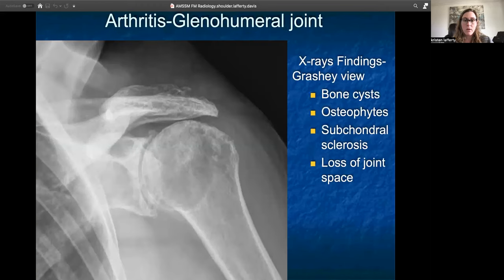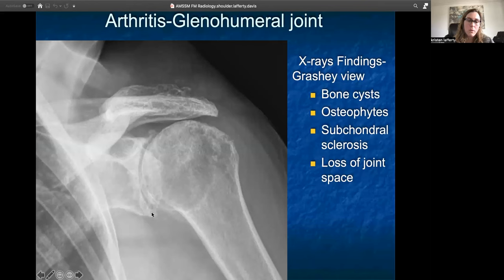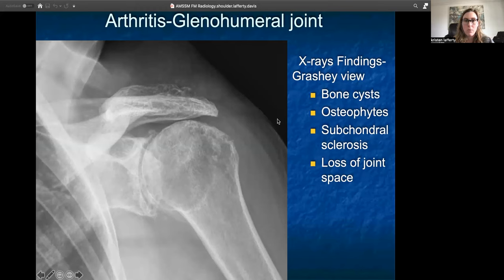Starting with arthritis of the glenohumeral joint, the Grashey view is the best radiographic view to look at that joint. Here we can see almost all the criteria being met for arthritis: bone cysts are the little black areas within the bone itself; osteophytes or bony projections coming off the superior and inferior portions of the glenoid; subchondral sclerosis, an opacification of the bone beneath the normal surface of the cortex that looks brighter white; and loss of joint space. This radiograph likely has some acromioclavicular arthritis as well.